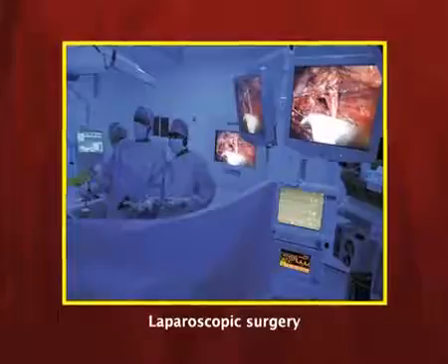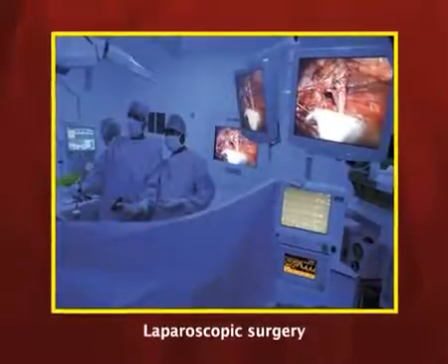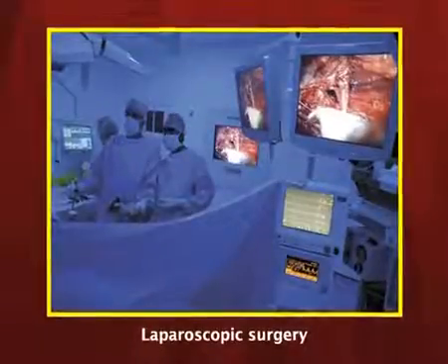Various kinds of monitors are available — medical monitors generate high resolution images and larger video screens are preferred. The monitor should be a minimum of 20 inches; a smaller monitor makes operating uncomfortable. The image should be non-flickering to avoid eye fatigue. A crystal clear, non-flickering 20 inch monitor will give you comfort and make your surgery a smooth journey. The telescope goes through the 10 mm port to begin the procedure.